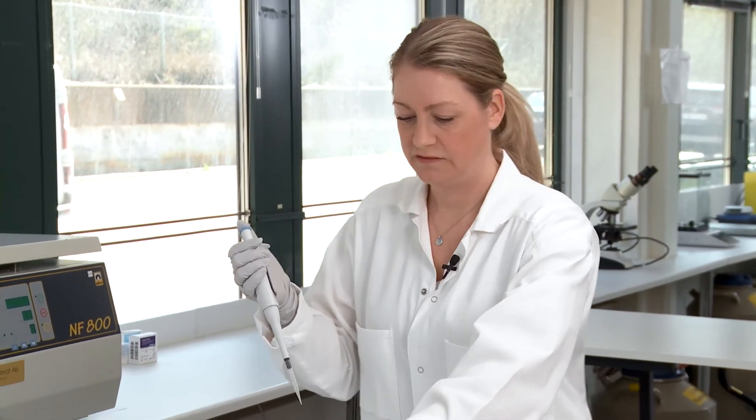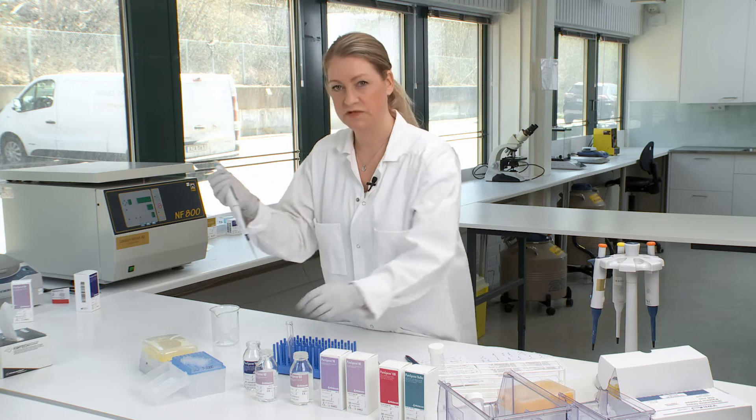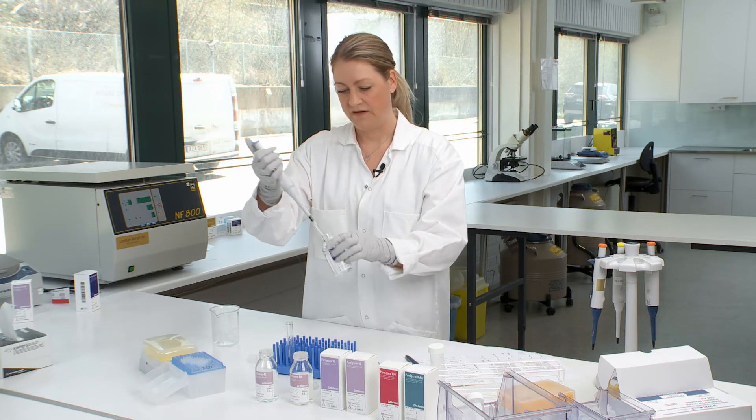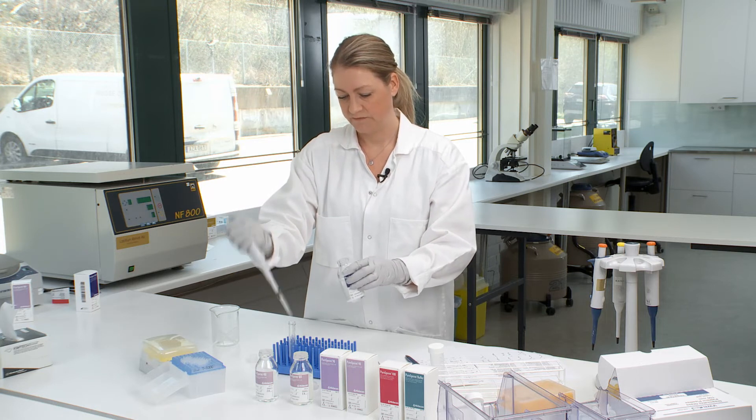While you're waiting for the gradient to centrifuge, you can add your washing medium to a new centrifuge tube. You add five milliliters of PureSperm wash.